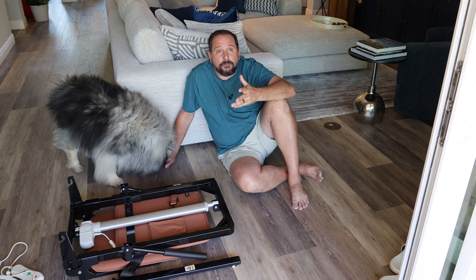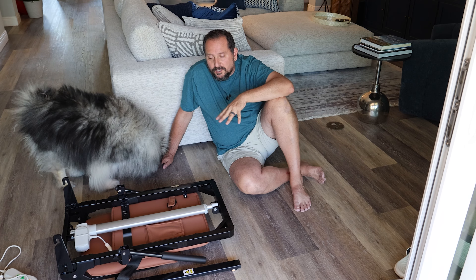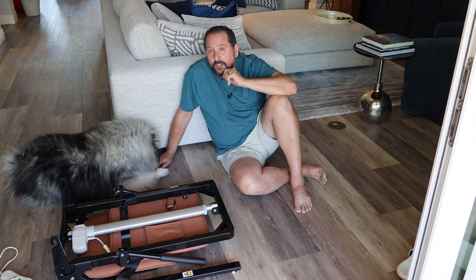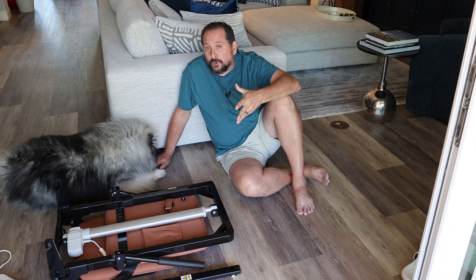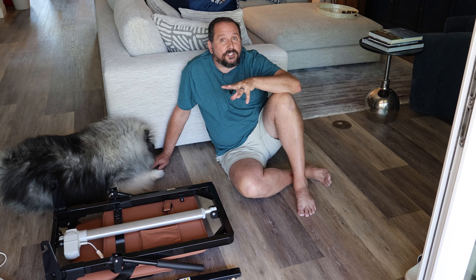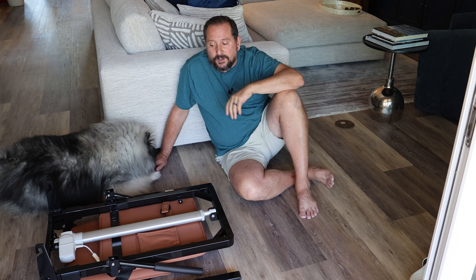I was young at the time, but if she had a partner who wasn't able to lift her up, it would be a real issue that this would absolutely resolve. So let's put it together real quick, make sure it actually works, and I'm going to show you some cool party tricks — like you can fold it up and roll it around. Let's get to that right now.